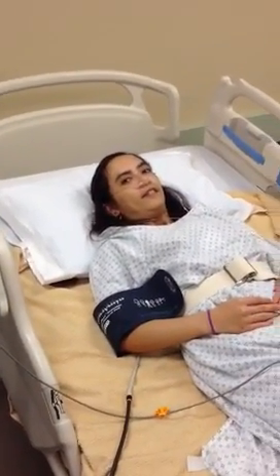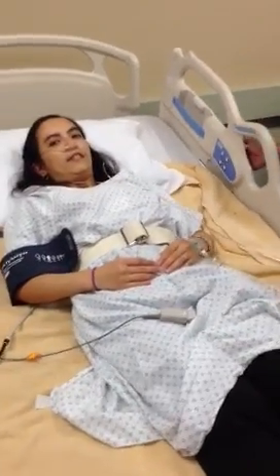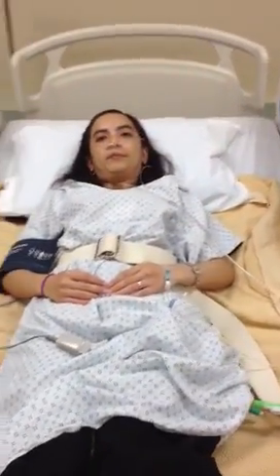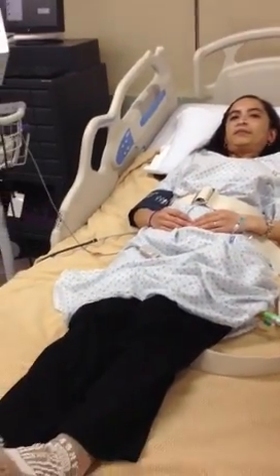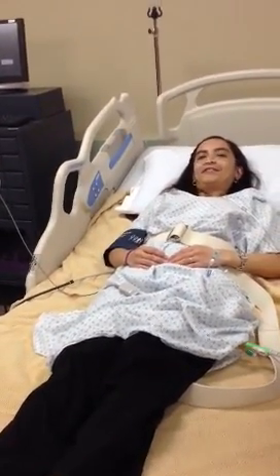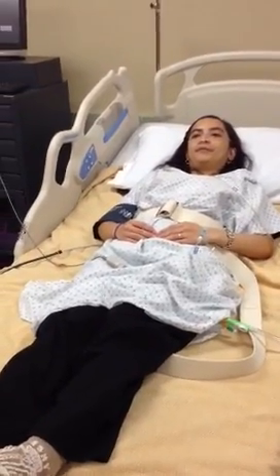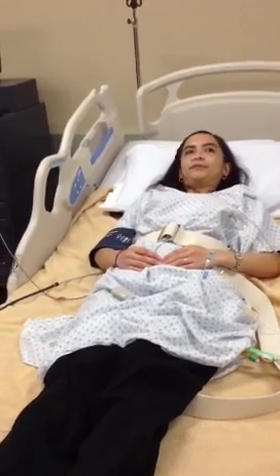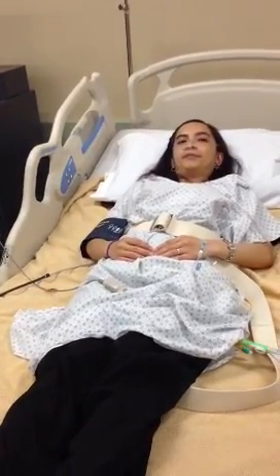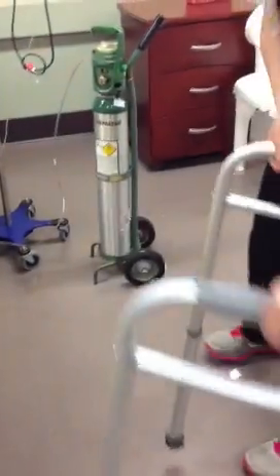Confirm that the bed is locked and it's at an appropriate height for your patient. If you have a tall patient, the bed will need to be higher. And if you have a short patient, like Verona, you will need to have the bed low and locked. Also, before moving your patient, assess that they are at an appropriate level of consciousness, and also have a wheelchair or walker within range of the bed.